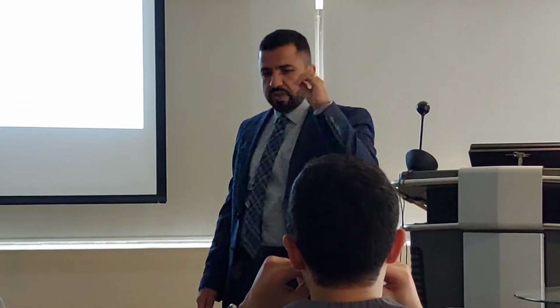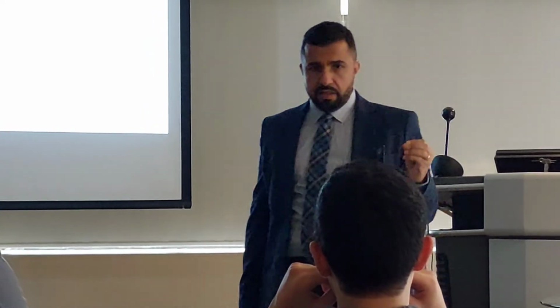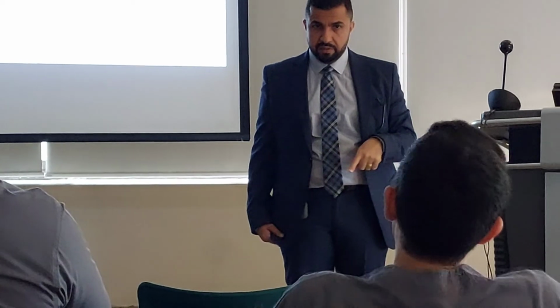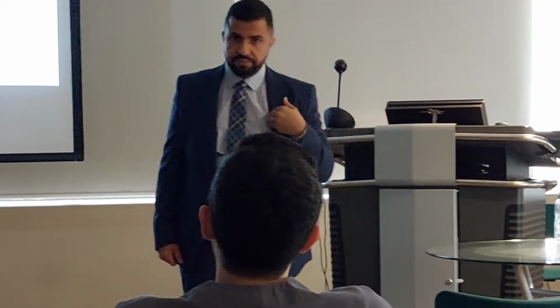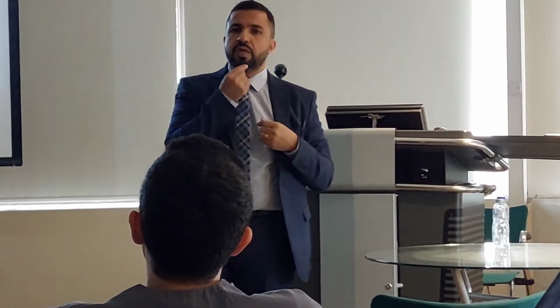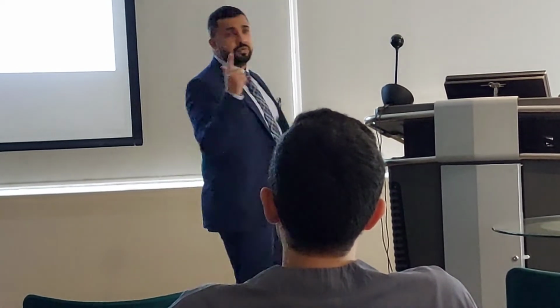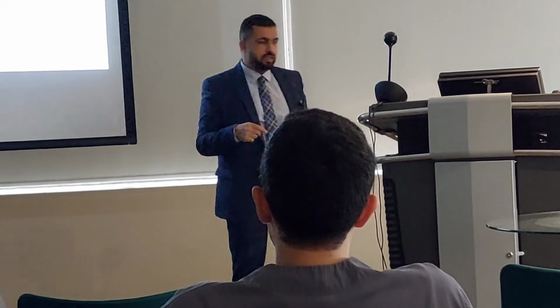If he is coming to his appointment, especially cardiac patients, though it applies to all, and you know that he will be late, discuss it with him. Maybe the delay is because of him, not because of you, and maybe you need more beta blocker. You need to explain to him because he is irritated now: why am I not going in for my appointment? They are not professional. This really increases the heart rate. Think about the simplest things. Caffeine is not allowed. It should be mentioned in the preparation letter, all these things.